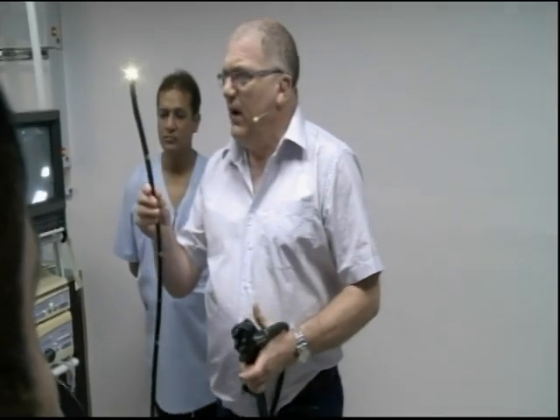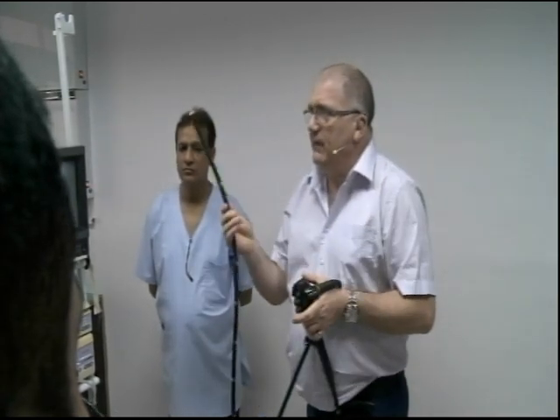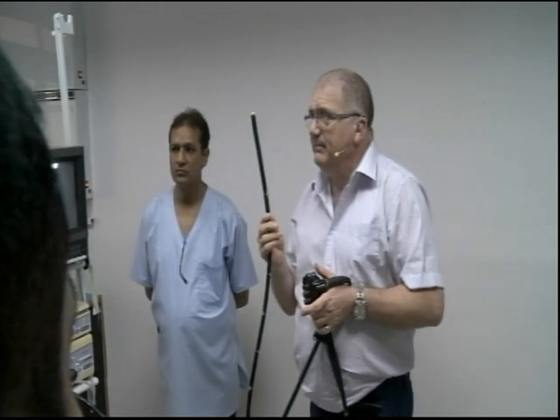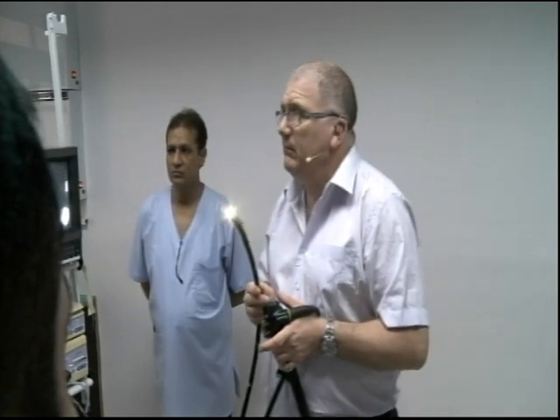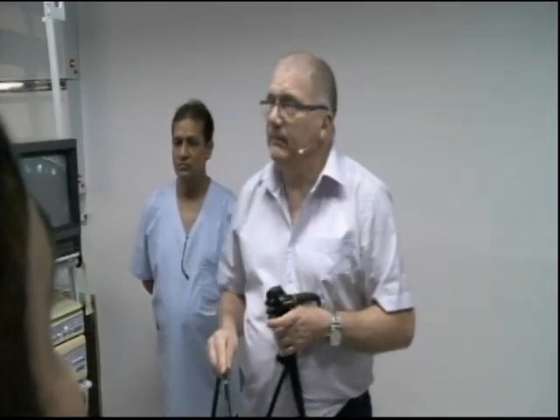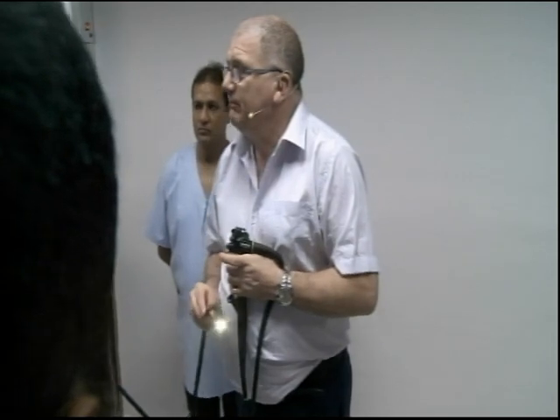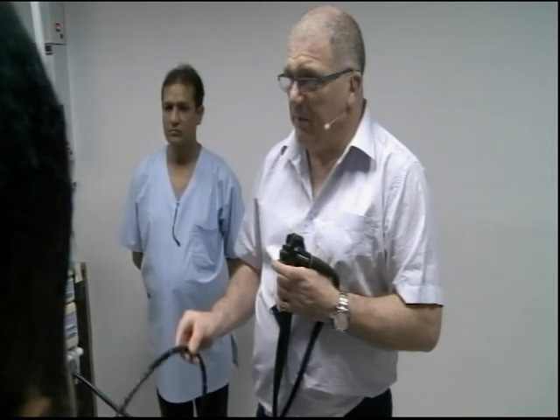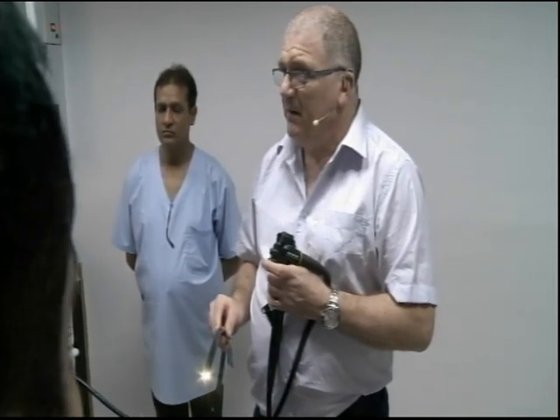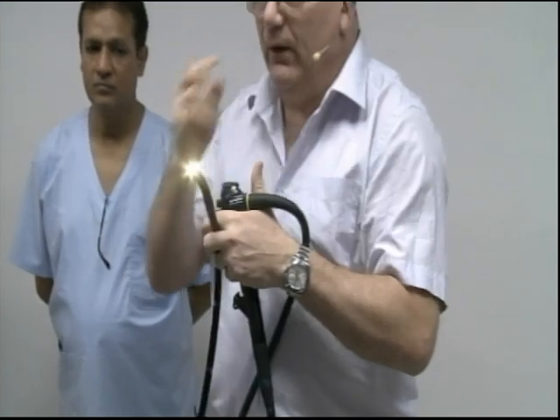Okay, so the angulation. What is the difference between the angulation if I do tip up to if I do tip down? How much can I angulate the tip if I do tip up? 160. And what about tip down? 160, 140. No idea. 90 up. And what about tip down? So if I pull the big wheel back, how much will this angulate the tip?